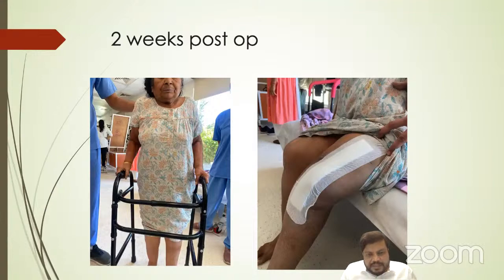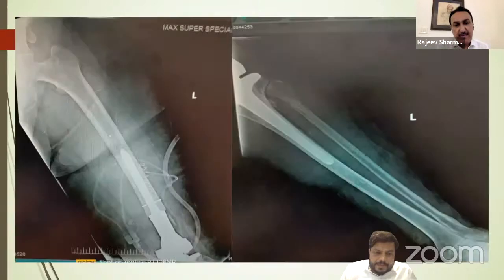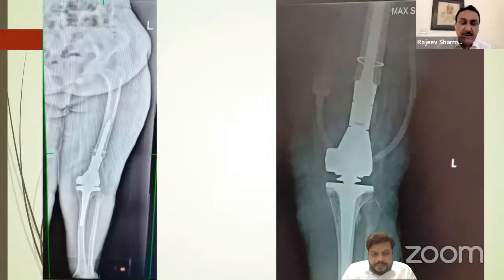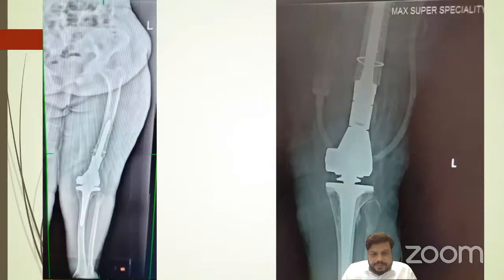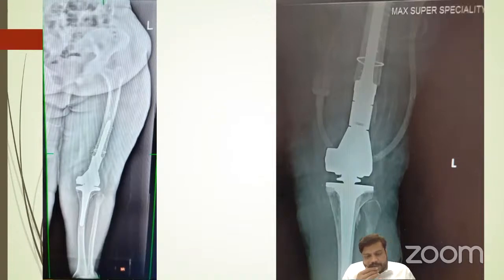This is how I manage the case. Dr. Gaurav, it's a well done case. Can we go back to your post-operative X-ray? So these are the X-rays. Right. So can I ask you here, this is the mega prosthesis with the extension attached to this? Yeah, S-ROM hinge prosthesis. Right.